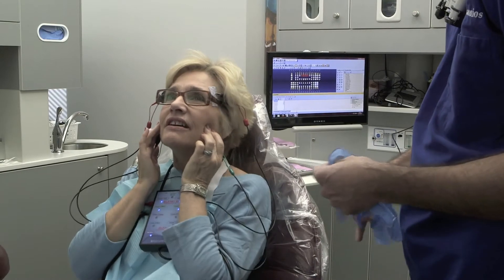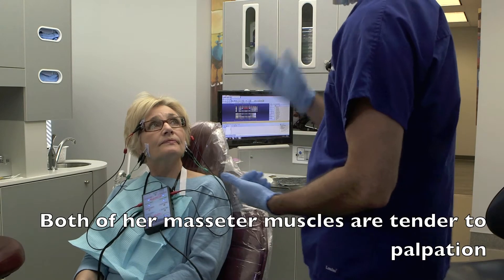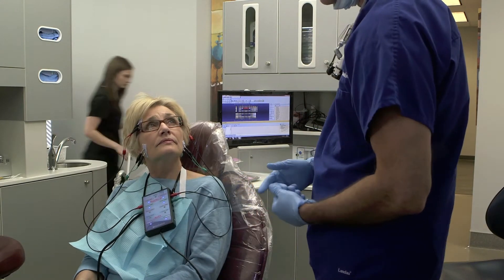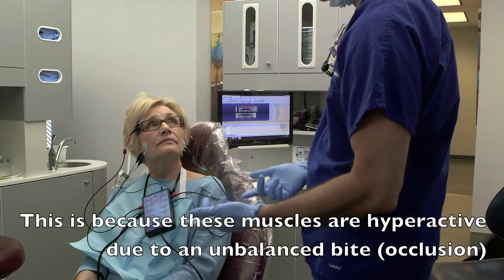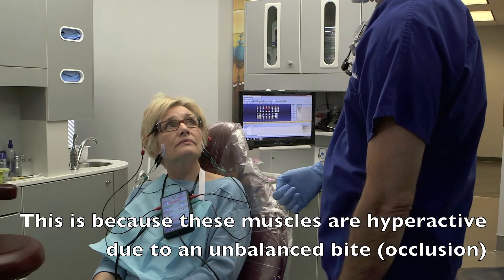When I push in really hard, it's sore. But I have to push in really hard. So you may be subclinical — I only feel it when I really push hard. But I have a feeling after I do this, it's going to be like, holy cow, he was right. I just feel loose. We'll see.